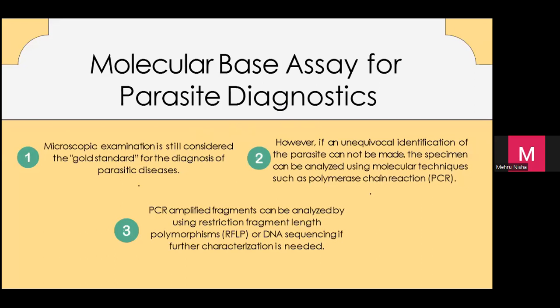At the same time, kalau saya bagi bacteria culture pada you, semua nampak macam kuning. Semua nampak rod shape. If rod shape, then you katalah, oh ini bacteria, tapi nama you cannot bagi. Same thing goes with fungal. Tapi, parasite is different. Di microscopy, you can actually see, oh yang ini Giardia, yang ni Trichuris, yang ni Ascaris, hookworm. It's very clear to your eyes. So that's why we still say, untuk parasite, the golden standard technique is microscopy examination. Okay.